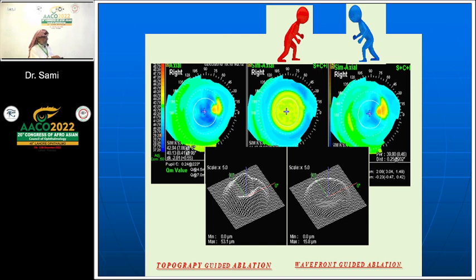This I used. This is the before. If you have a good shape, this is topography guided. If you have bad shape, you are not looking for the shape. You are looking for the function. Because sometimes you have an abnormality on the surface of the cornea that's been corrected by another abnormality down, either the back of the cornea or the lens. And if the machine looks at them at neutral, so when you look at function, you don't correct them because they are correcting themselves.